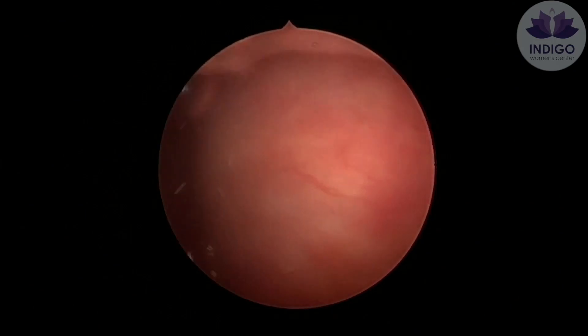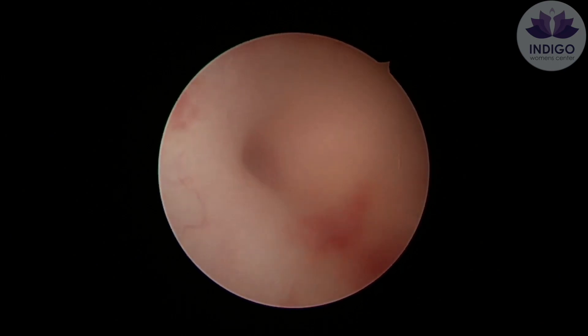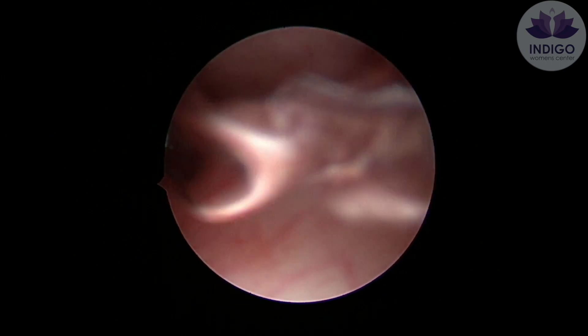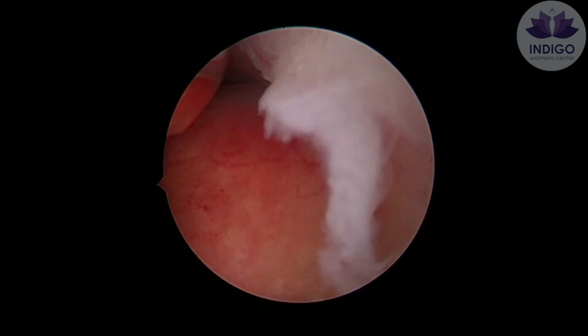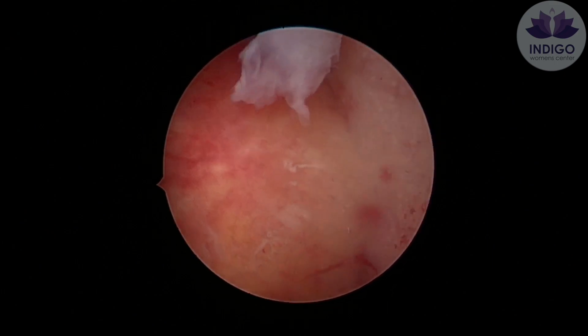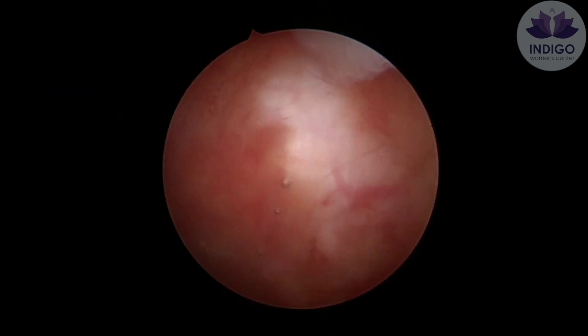The reason why we are demonstrating this procedure today is to show you certain tips and tricks that you have to incorporate in your practice to make this procedure easier. At the same time, we also want to address certain important things that need to be kept in mind before performing a hysteroscopic resection.